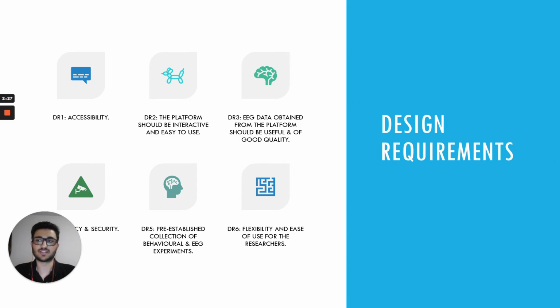Our first design requirement is accessibility, as such a platform should be accessible to everyone and should not be limited to a type of device. The platform should also be interactive and easy to use to maintain participant engagement. EEG data obtained by the platform should be useful and of good quality. The platform should be private and secure enough. There should be a pre-established collection of behavioral and EEG experiments for the participants to start with. And there should be flexibility and ease of use for the researchers who don't necessarily have a computer or a technical background.